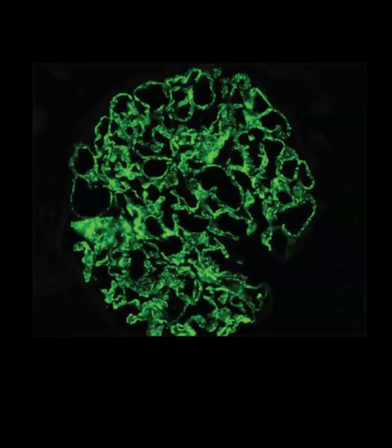I am asking Dr. Sarah, can you tell me in membranous nephropathy, are there either fine granular deposits or coarse granular deposits? Lupus nephritis is possible. Fine granular deposition of IgG along the capillary loops.